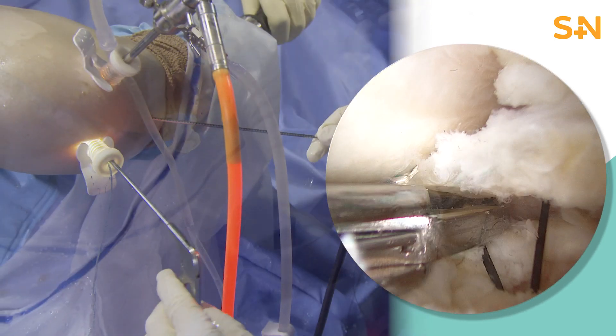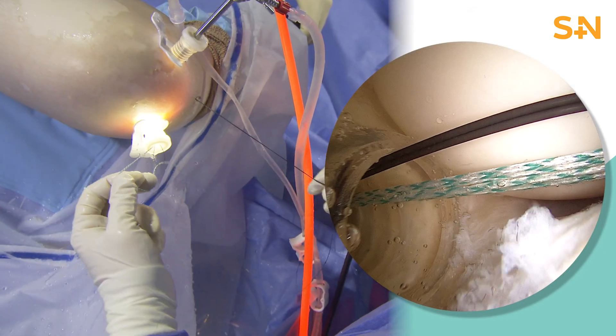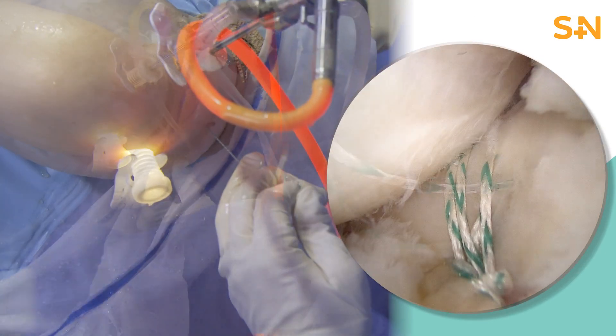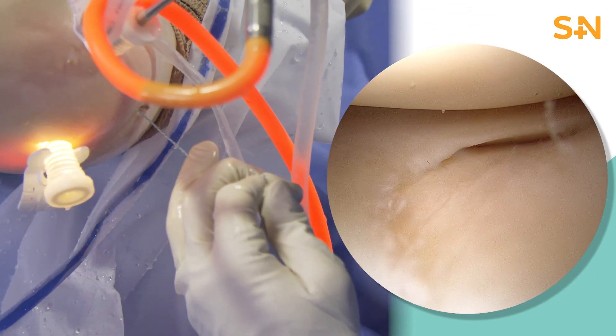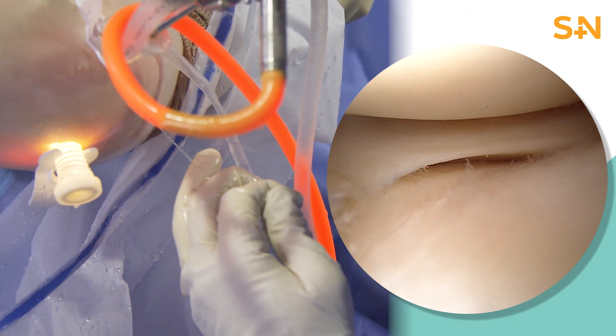You can see the two modified double locking stitches through the meniscus. This is then passing a nitinol wire through the tibia. I find that a cannula is a great way of avoiding tissue bridges and making this case go easier and smoother. You now see the excellent fixation in that posterior lateral root with good integrity of the lateral meniscus.